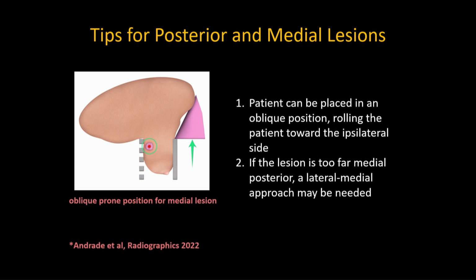So some tips for posterior and medial lesions. Again, you can roll the patient obliquely to the ipsilateral side, and if you cannot get it from the medial approach, you're going to have to take a lateral approach.